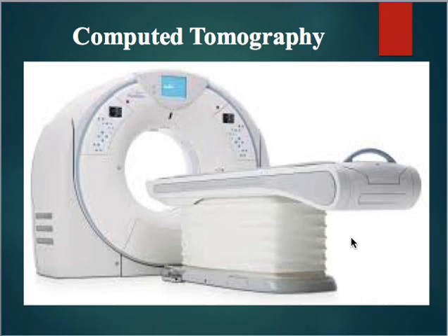So if you take a piece of that bread out and look at it individually, you can look at it from the top or the bottom, and you can see if something is inside of that loaf of bread in each individual slice. So we wouldn't miss something that's really small. You can put that slice back in and then pull another slice out and look at that more in depth, and put that one in, and so on and so forth. So a CT scan is essentially looking at a loaf of bread, but using the body instead and being able to view each one of those slices individually to look at the anatomy and see if something is going on.